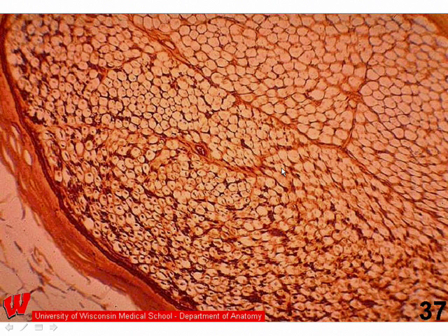In the middle of this large nerve, you can see many, many myelinated axons in cross-section. Here is a blood vessel which is supplying the axon, and the dark staining in between is endoneurium.